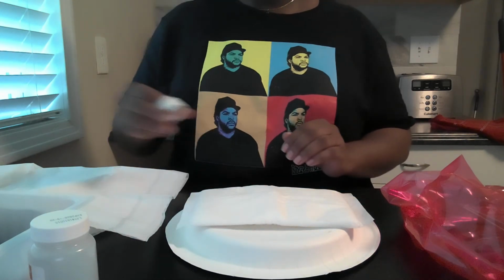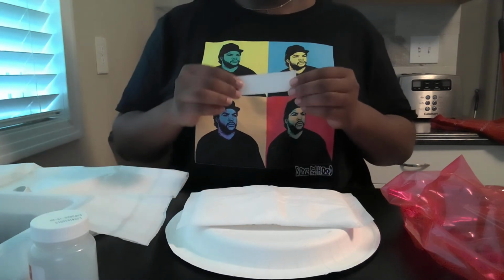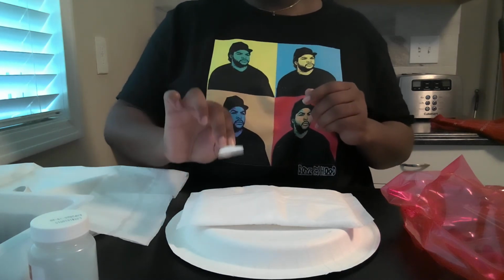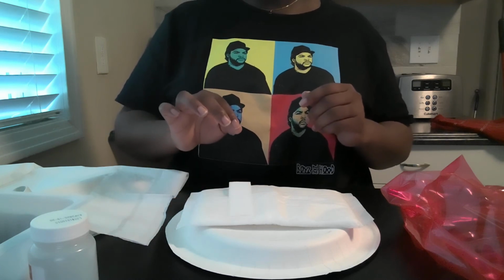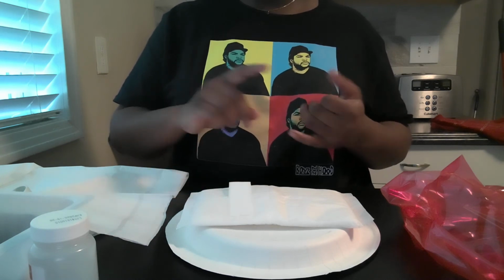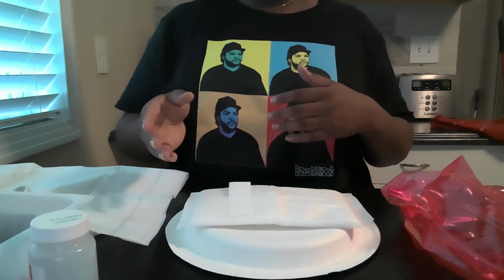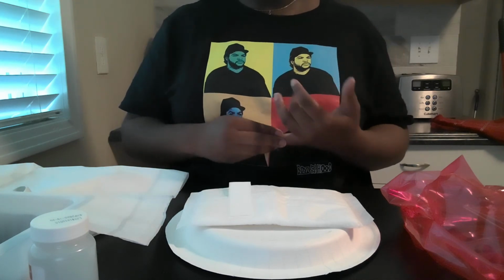Once you've done that, which is important, you want to label the wound. You're going to label it with the date, time, and your initials, just so the person after you knows when the last time the dressing was changed and who changed it.